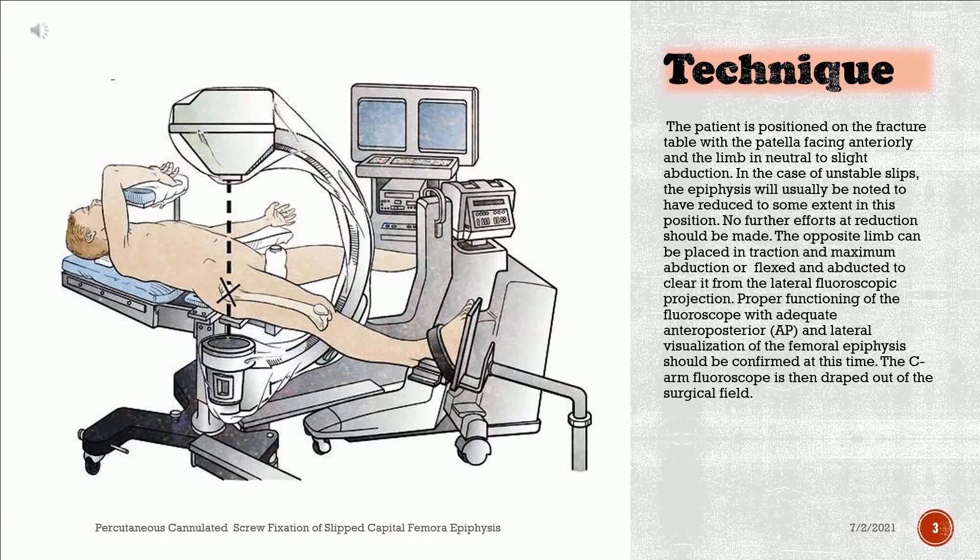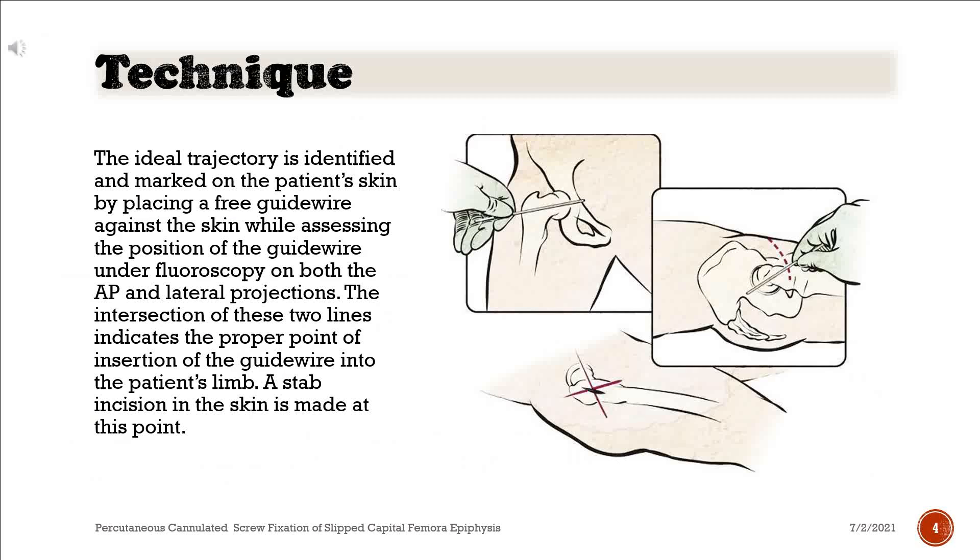Proper functioning of the fluoroscope with adequate anteroposterior and lateral visualization of the femoral epiphysis should be confirmed at this time. The C-arm fluoroscope is then draped out of the surgical field. The ideal trajectory is identified and marked on the patient's skin by placing a free guide wire against the skin while assessing the position under fluoroscopy on both the AP and lateral projections. The intersection of these two lines indicates the proper point of insertion of the guide wire into the patient's limb. A stab incision in the skin is made at this point.